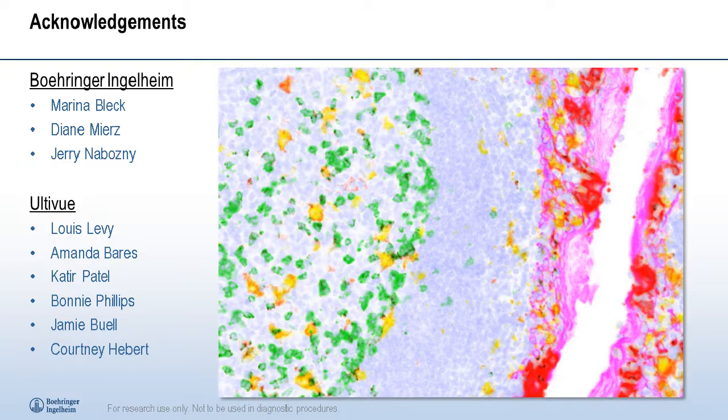That being said, I think that would rely on you having kits available with targets of your interest. So it might take you a little bit longer to optimize a fresh assay, because you would have to optimize your IHC conditions for that single antibody and send it to Ultivue for conversion or labeling and enablement with their assay system. That being said, it seems like once you have a repertoire of antibodies, we should be able to, in theory, mix and match them very quickly to develop assays without much in the way of optimization time.